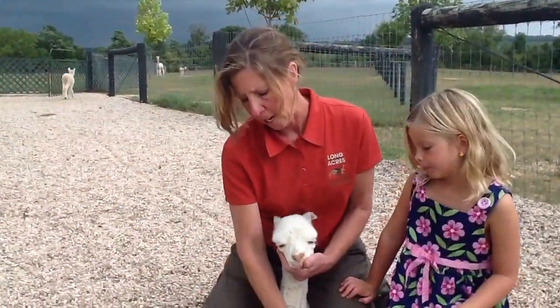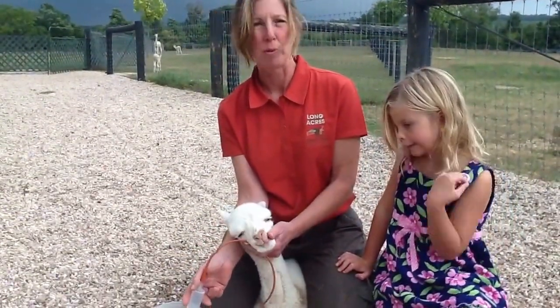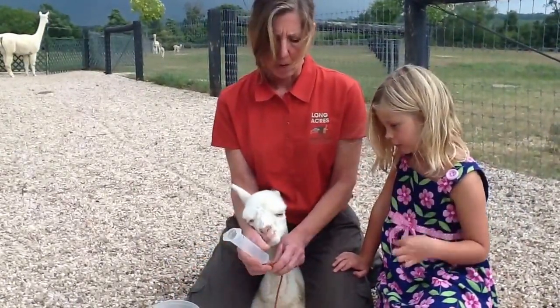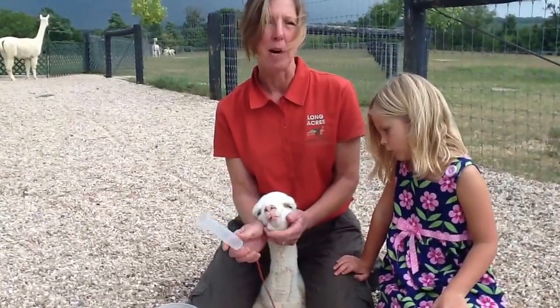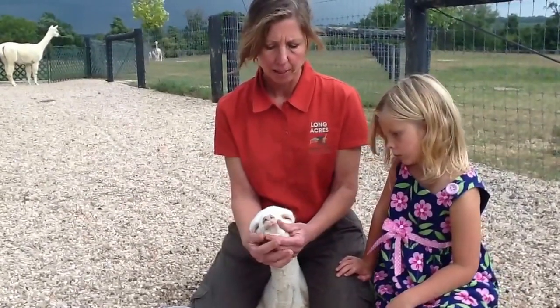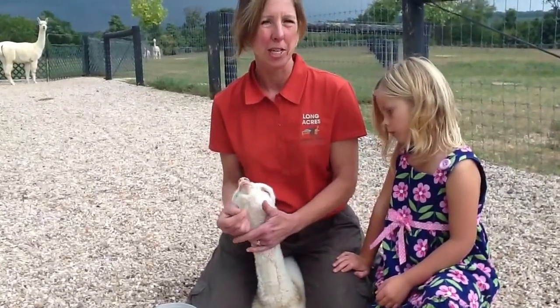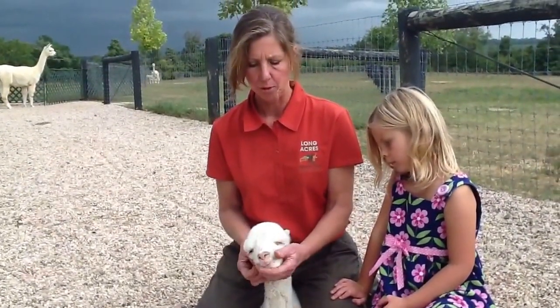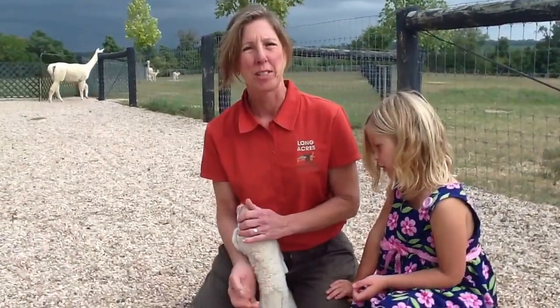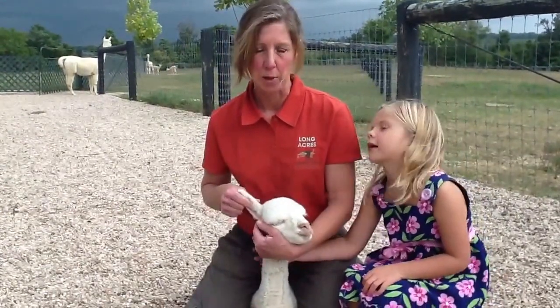Another way is, once it's in place, if you were to stick this end in water and there would be bubbles coming up, that would mean it's in the lungs. Once in a great while I've had an air bubble pop up, and actually it's been in the stomach — I think that's just a little bit of air that's in the stomach. It's really a very easy procedure. You don't want to force it down; just wait and they'll swallow it. Your biggest risk is going to be that you can traumatize the esophagus or they can aspirate your liquids.